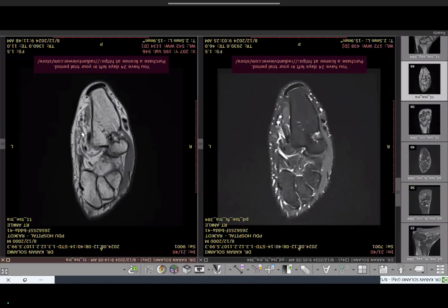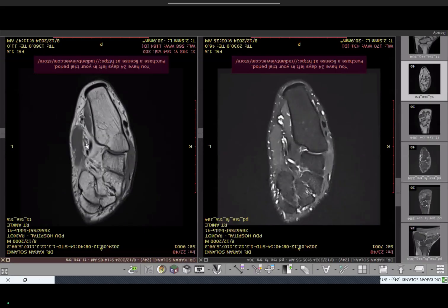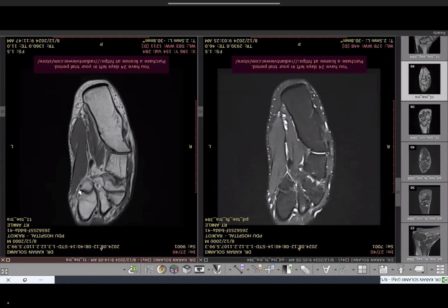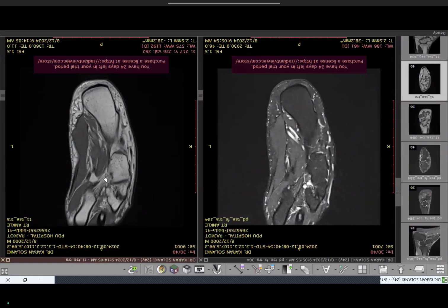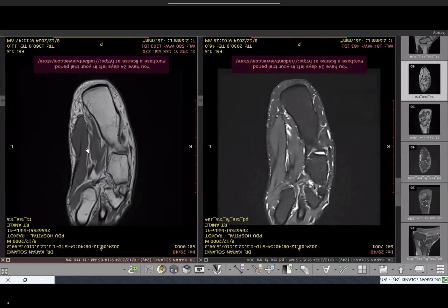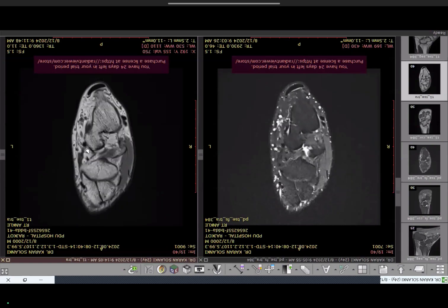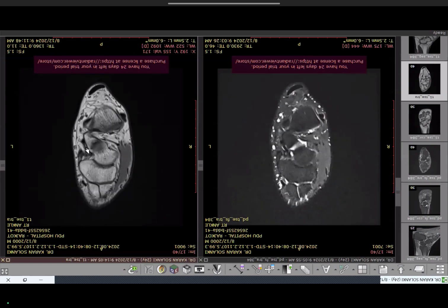Flexor hallucis longus is the posterior-most tendon. It has to cross over the flexor digitorum longus to insert at the base of the first toe. This crossover in the sole of the foot is known as the Knot of Henry. Flexor digitorum crosses and inserts at the base of the second to fourth phalanges, while flexor hallucis crosses and inserts at the base of the big toe. This crossing point is the Knot of Henry.